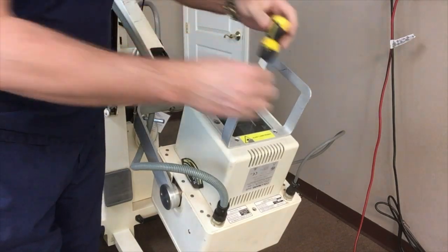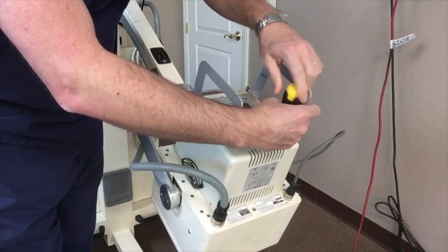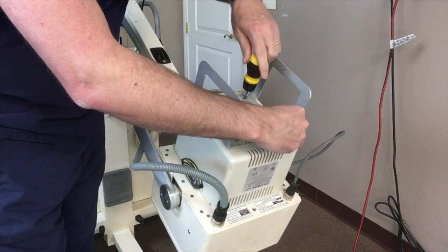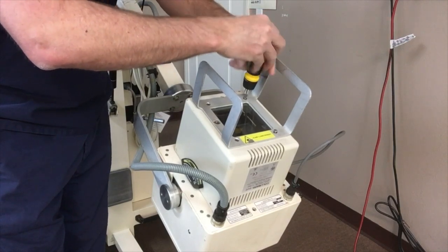Once you've removed that, you loosen the four screws on the skin guard. The skin guard is the only thing holding the collimator housing in place.